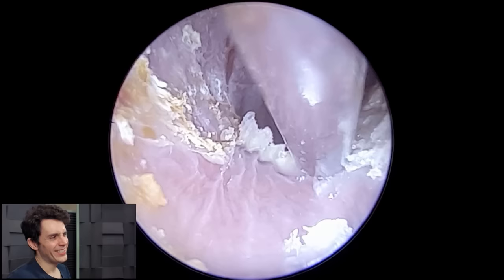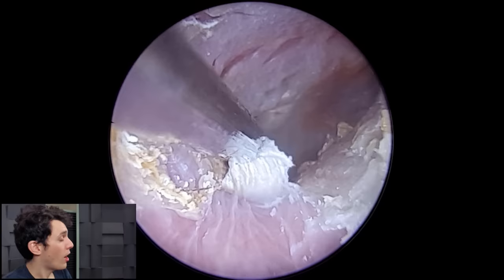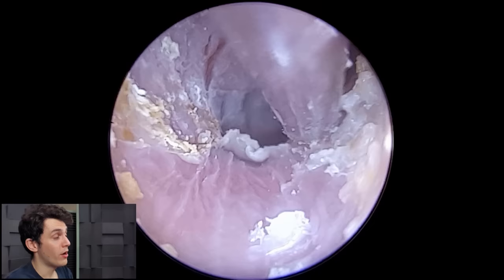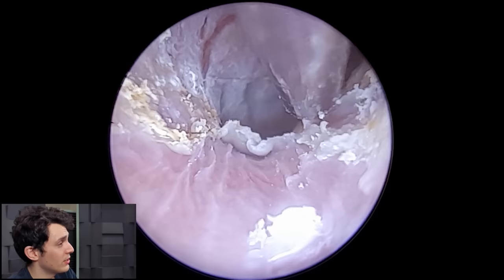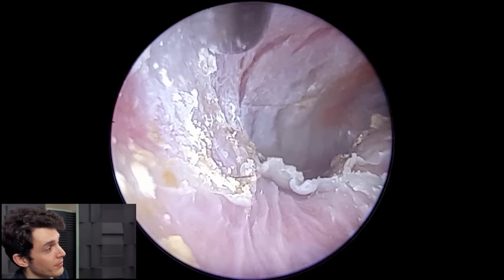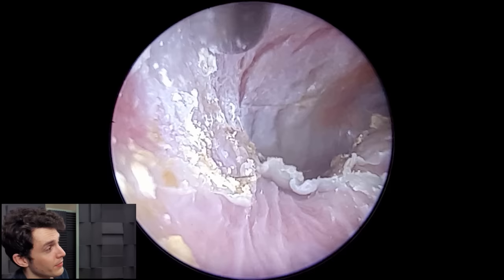Unfortunately at this point the patient was finding this a little uncomfortable, so we didn't get very far and the patient will need to be followed up. Hopefully what should happen is that the white skin coating the ear canal will dry and flake away, denying those microorganisms their food source. However, if any of this dead skin were to get wet and soggy it would return to ground zero and give the otitis externa a chance to reoccur. Overall, this is a fairly good outcome — the patient was certainly feeling and hearing a lot better after the procedure.